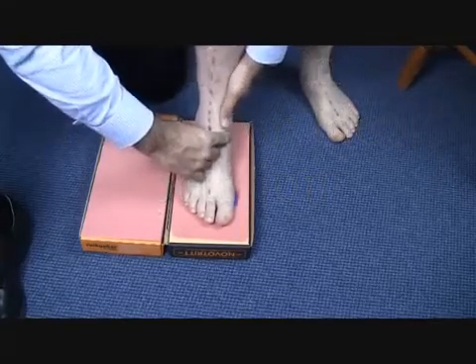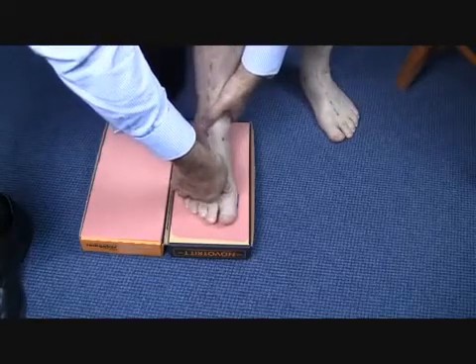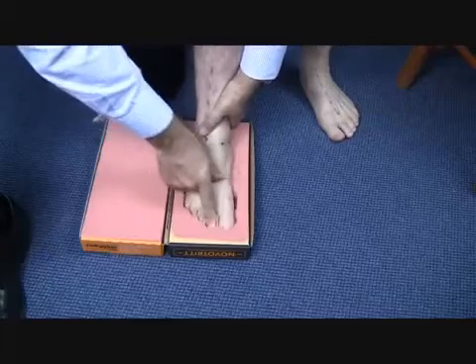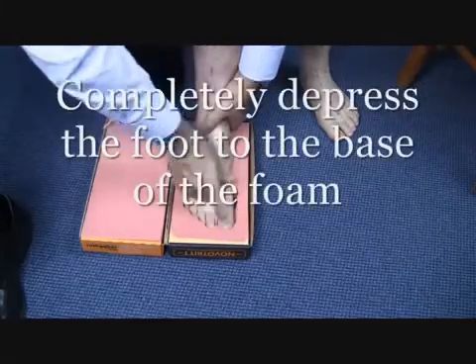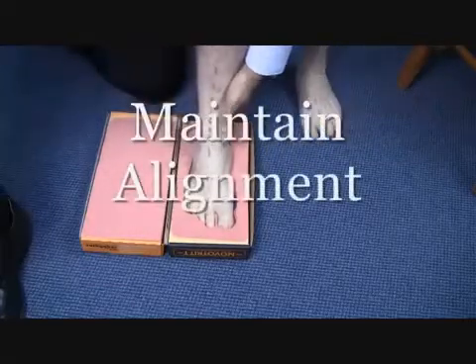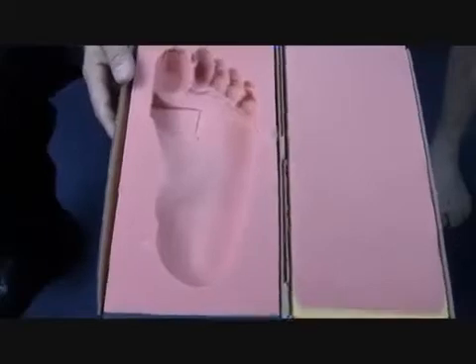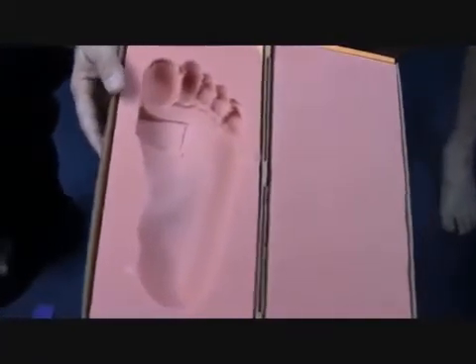Whilst maintaining the position, rock the foot anterior to posterior to break the foam, then depress the foot completely to the base of the foam. Continue to maintain the alignment whilst lifting the foot vertically from the foam box. Once you remove the EVA block, the forefoot varus will be revealed in the cast.